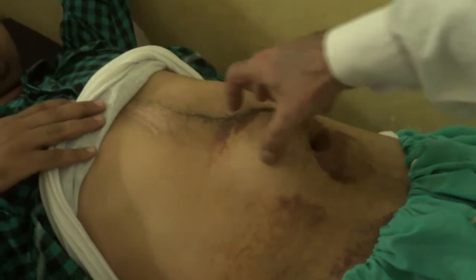And this is the patient where I was scanning once again to show you that this is the bulge after the trauma, and this is the umbilicus. It's in the midline, expands on both sides, and what you have seen in the picture is consistent with hematoma formation, that is extraperitoneal.